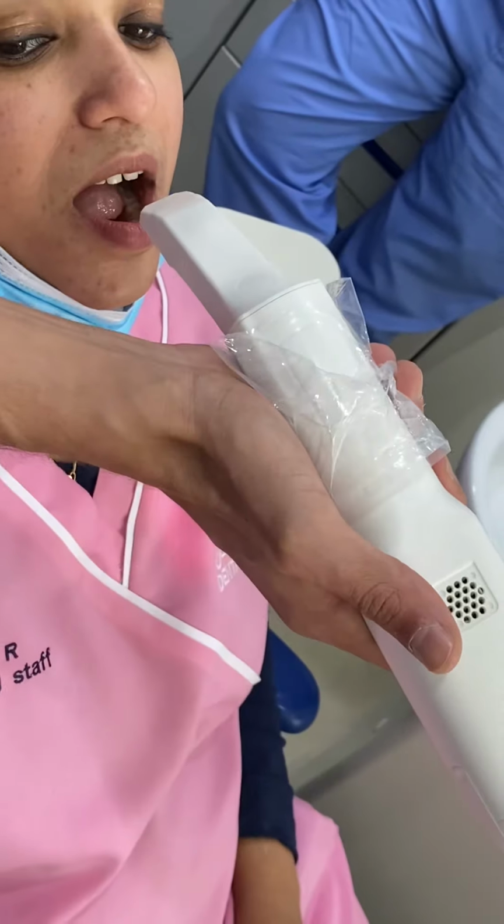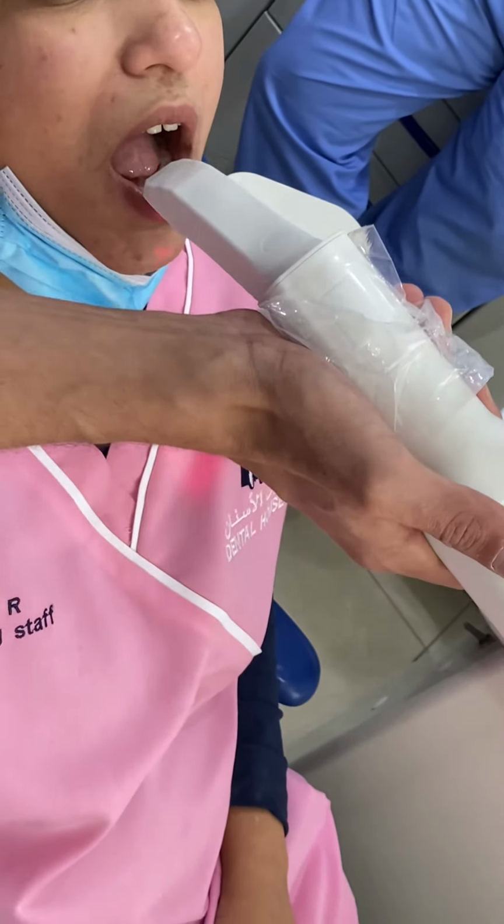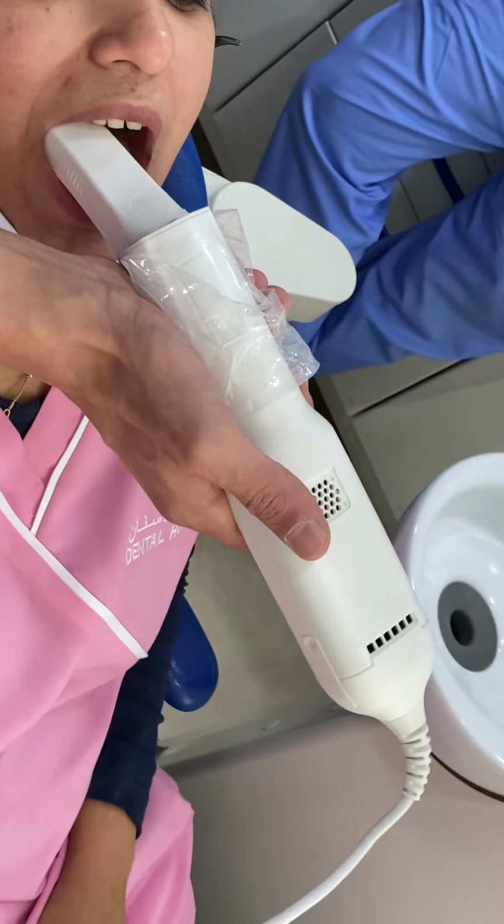We'll start with the wide open. So start with the open first. Can you open wider than this? Very good.